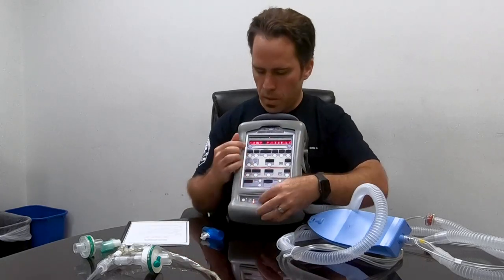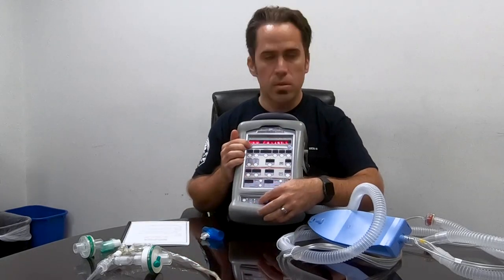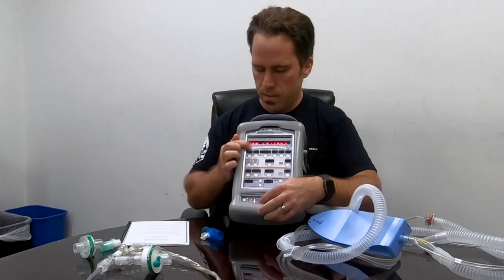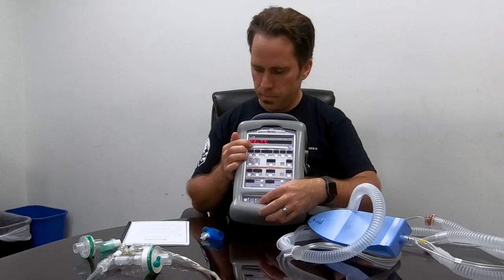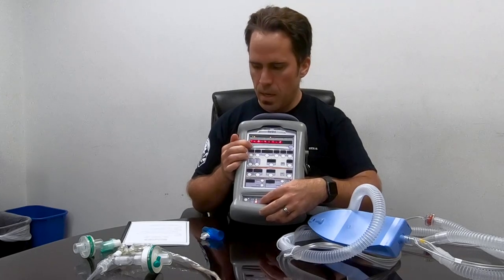Following the sheet, I scroll to New Patient in the red and hit select, then scroll to Patient Size, hit select, scroll to Adult, hit select, and then pick Invasive/Intubated.